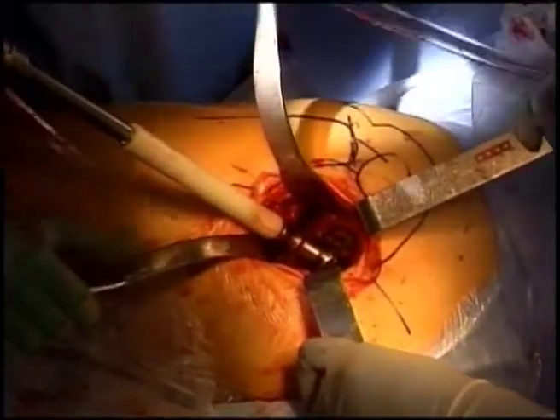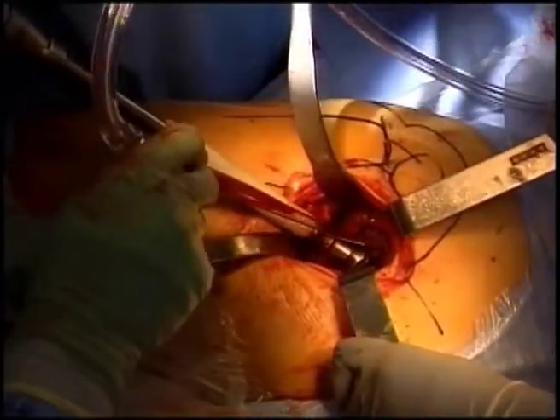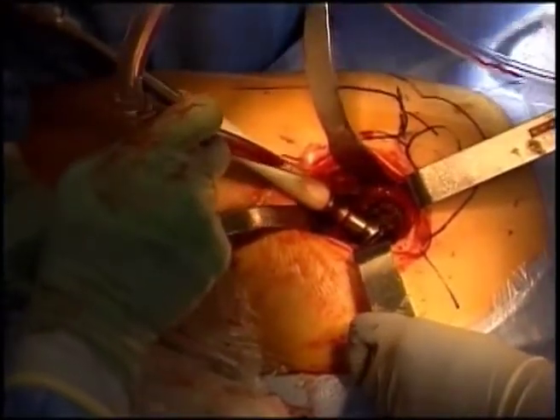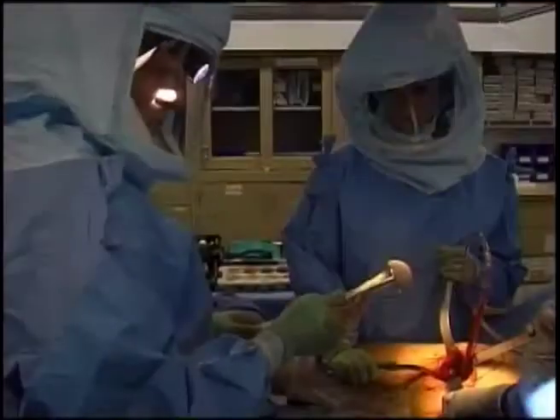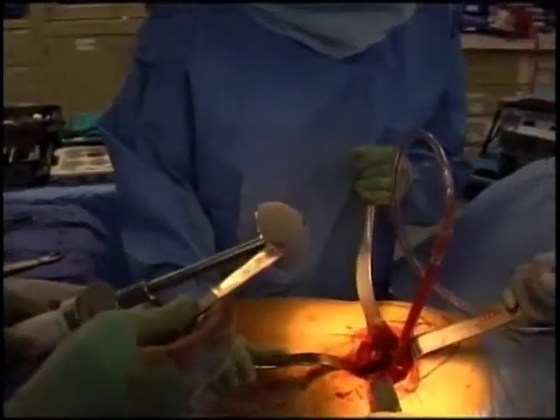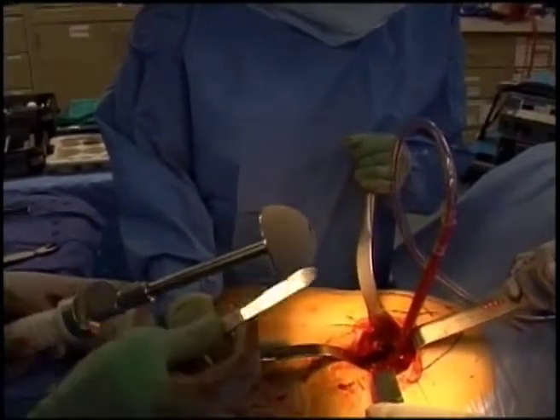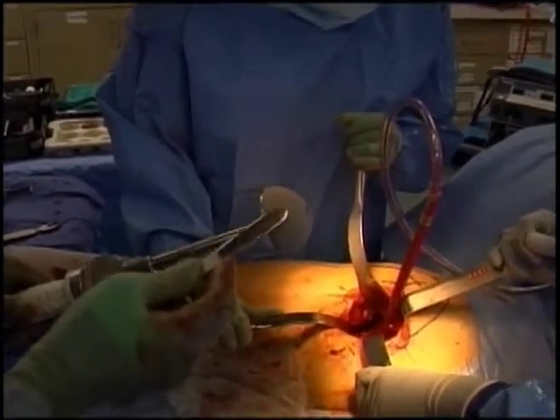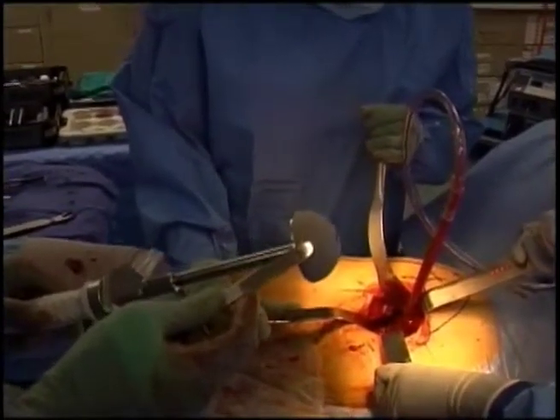Now the final reamer is in place and we've enlarged the cup to 61 millimeters. We'll therefore place a cup that's one millimeter larger — 62 millimeters — which will press-fit into the bone to give a snug fit without needing any screws or bone cement. This is the cup portion of the hip replacement, covered with titanium beads that will help lock it into the bone. Ultimately, the bone will grow against this titanium roughened surface so the metal essentially becomes part of the bone — that's how hip replacement can be done without bone cement.